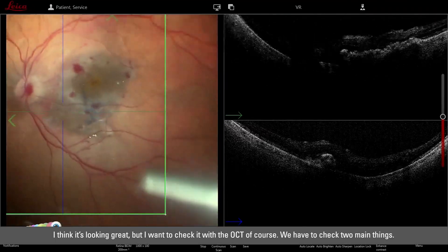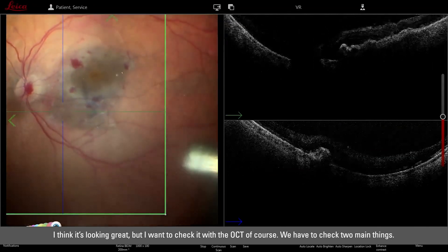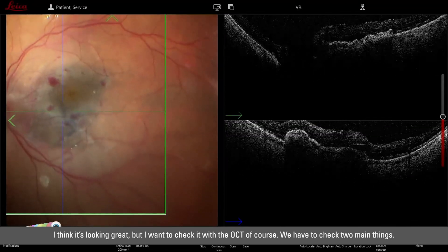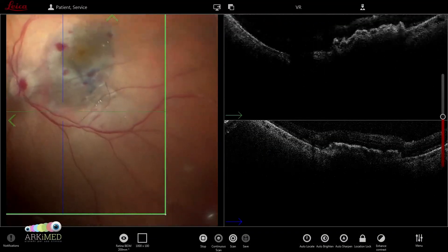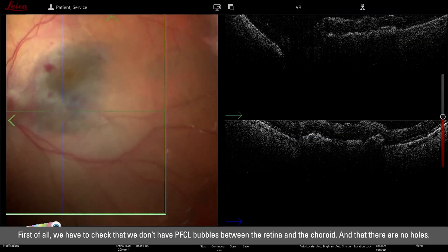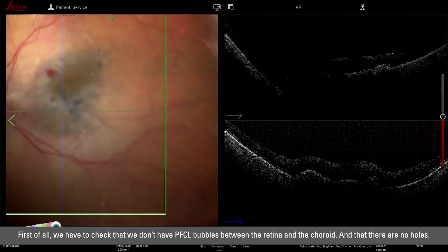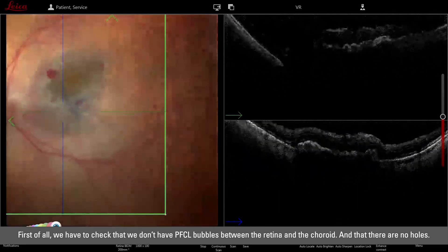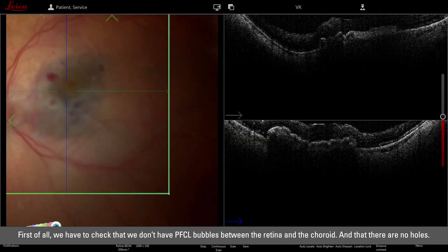It's looking great but I want to check with the OCT. We have to check two main things: first, that we don't have PFCL bubbles between the retina and the choroid, and second, that we don't have a hole.